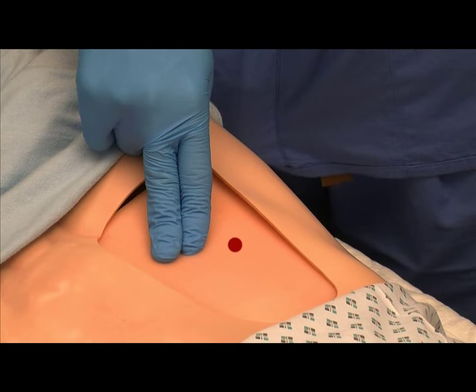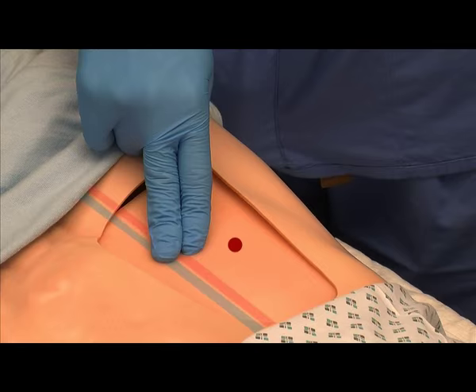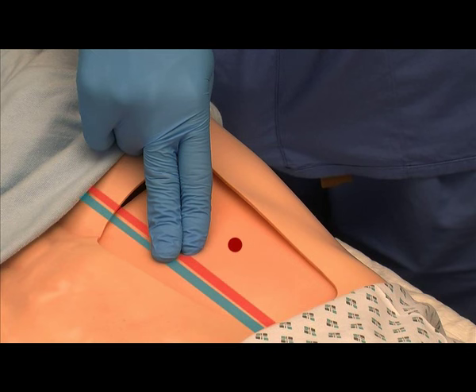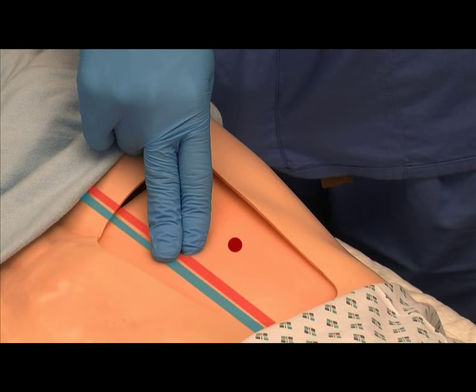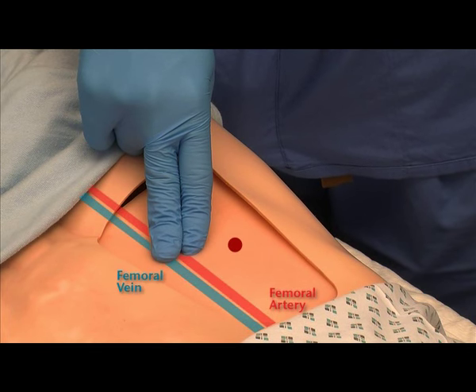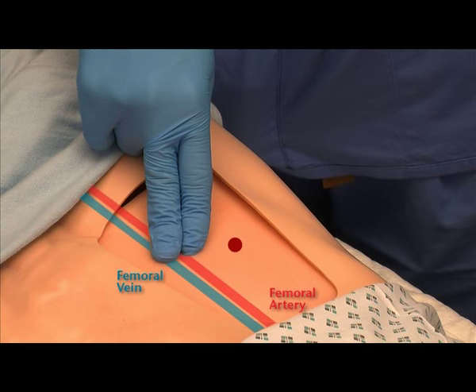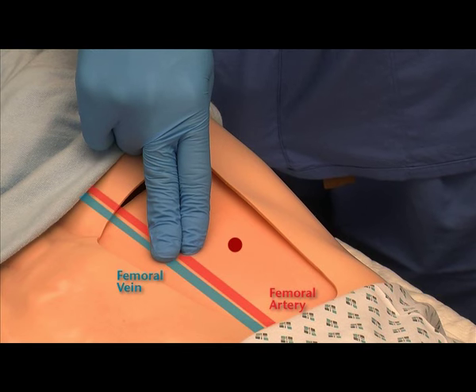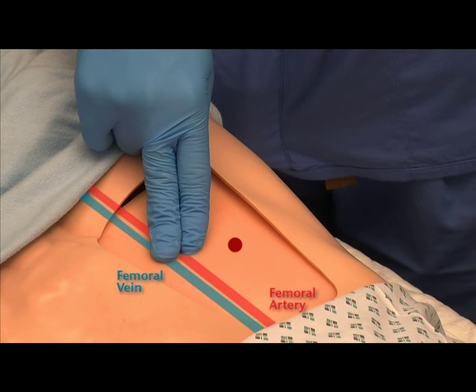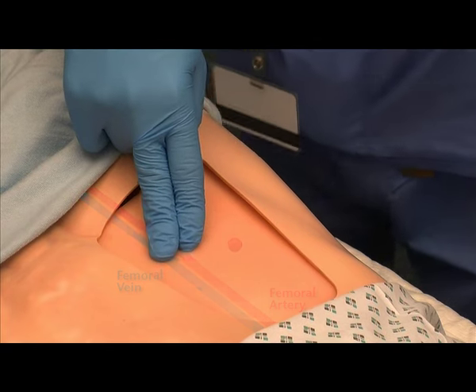Palpate the ipsilateral femoral pulse at the level of the planned injection site. The pulse should be palpable 1.5 to 2cm medial to the intended injection point, to ensure a safe distance from the major vessels and avoid impalement.